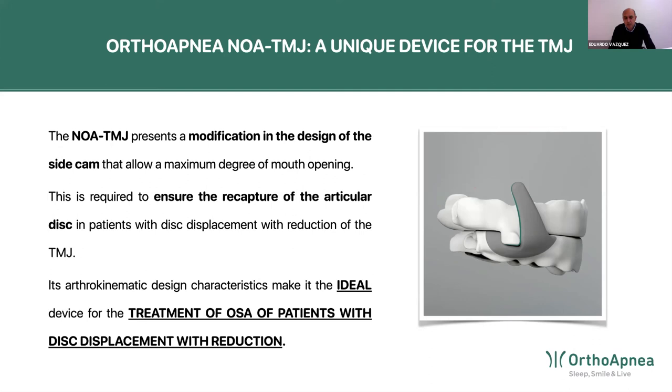In this sense, we have made a variant. We have changed the design of the lateral cams so that the patient is able to place the MAD in the mouth. Once the MAD is placed in the mouth, the patient is able to open the mouth completely and provoke the click. So the patient opens the mouth to provoke the recapture of the disc. The disc gets in place when the patient opens the mouth, and then the patient closes in a protrusive position, the one that we have decided, 50, 60%, and then stays in that position.